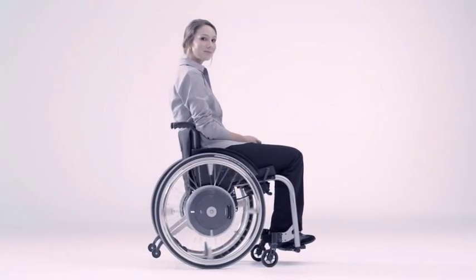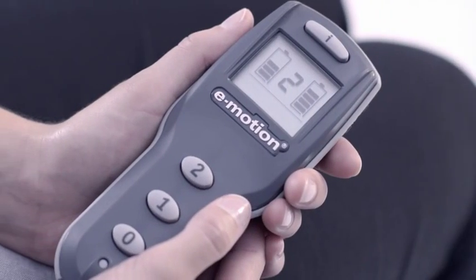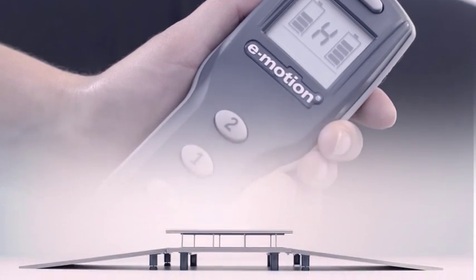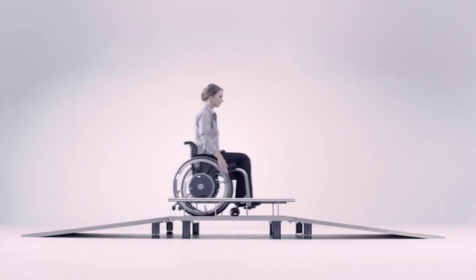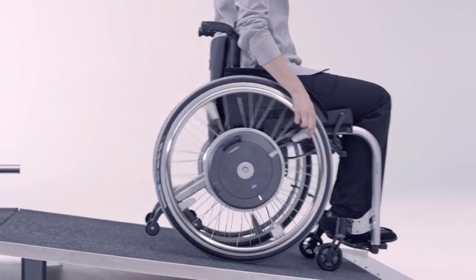Thanks to progressive drive technology, the motors run without a sound. A rollback delay activated at the push of a button keeps you safely in position when going uphill. When travelling downhill, the power assistance also boosts the braking pulse to give you greater safety.